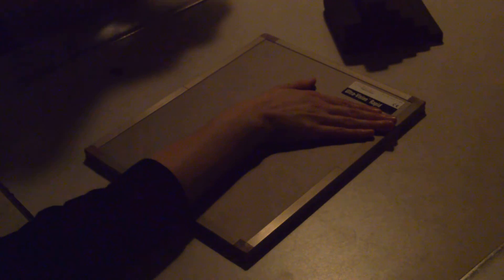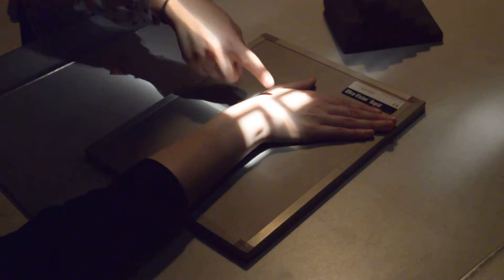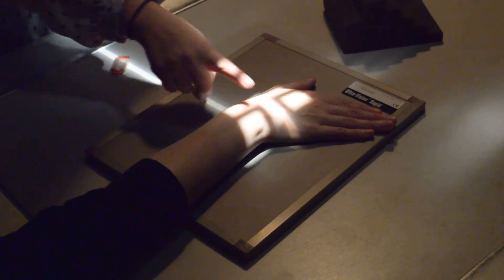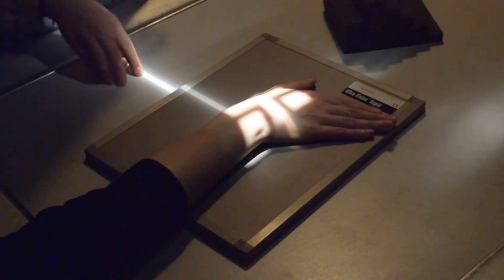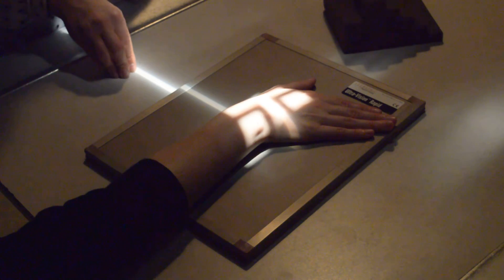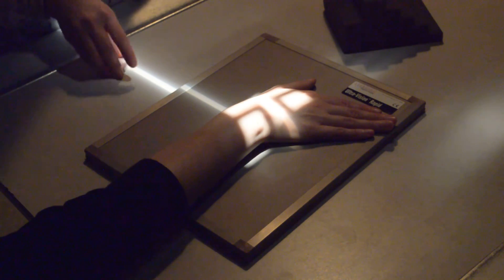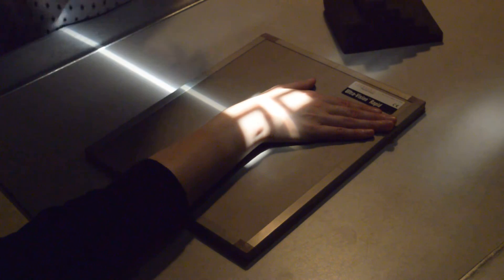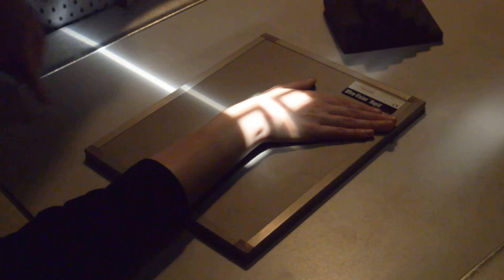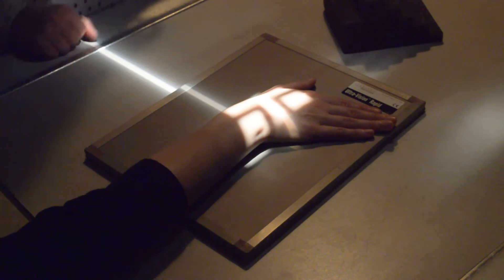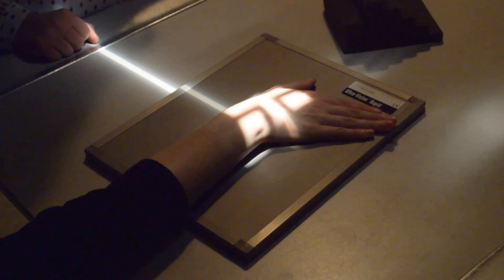The bone that you're concerned with looking at is the scaphoid when we do the ulnar deviation. You will still be able to see a small portion of the metacarpals. And you'll be able to visualize a small portion of the distal radius and ulna. Your marker, good positioning. Measure right through your central ray. Ask your patient to hold still. And click.